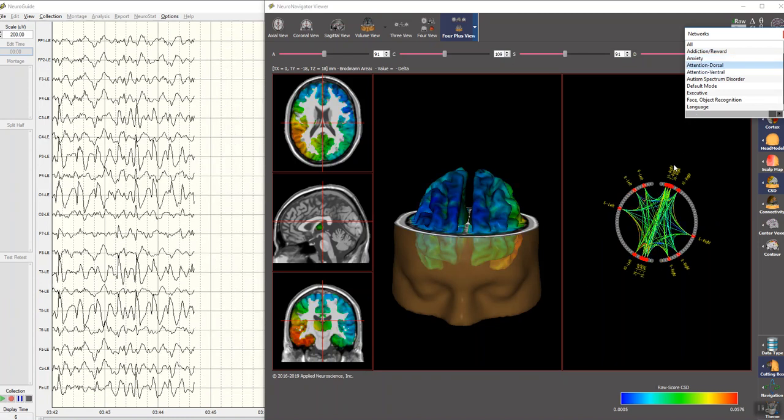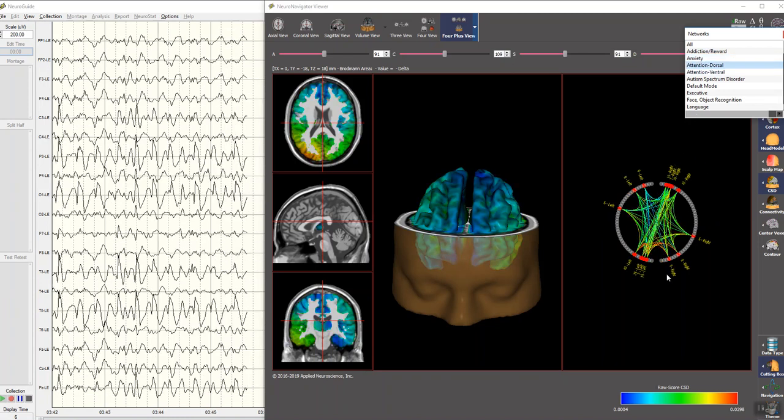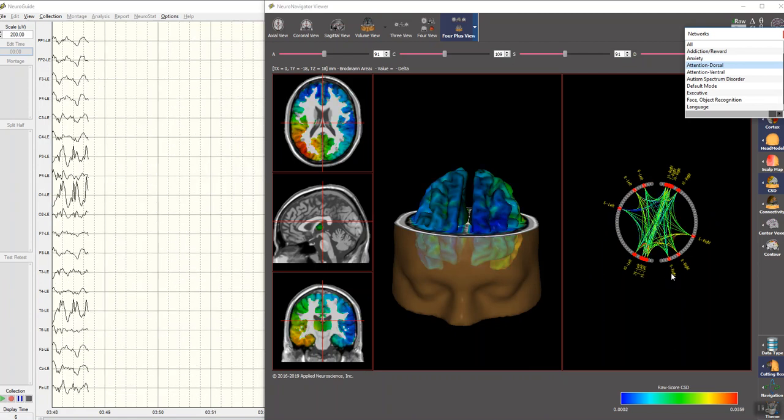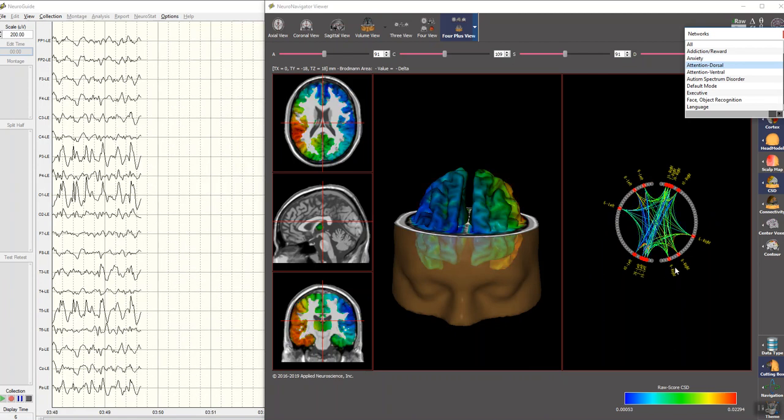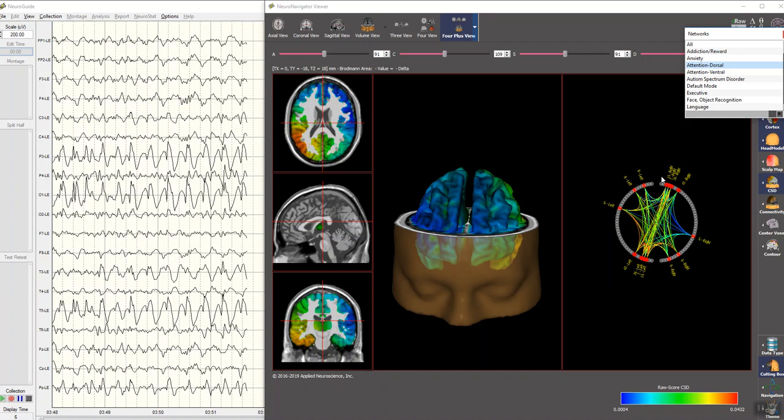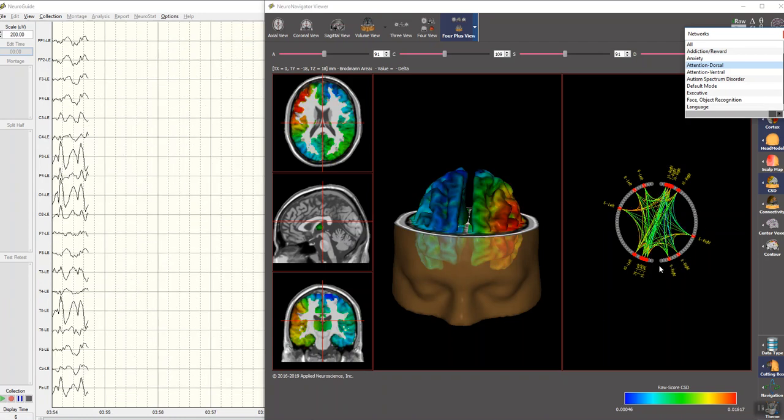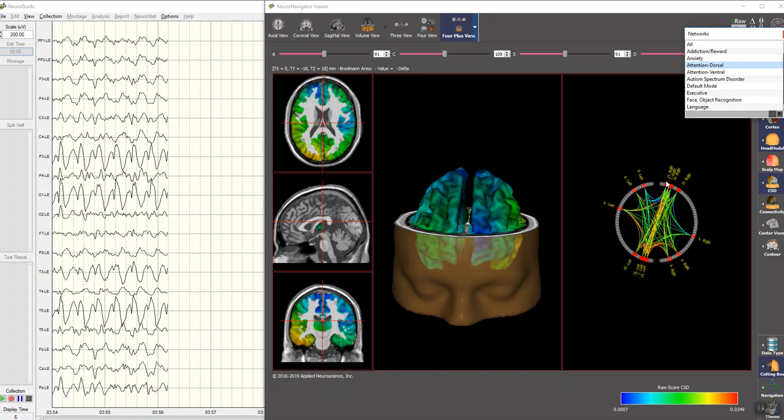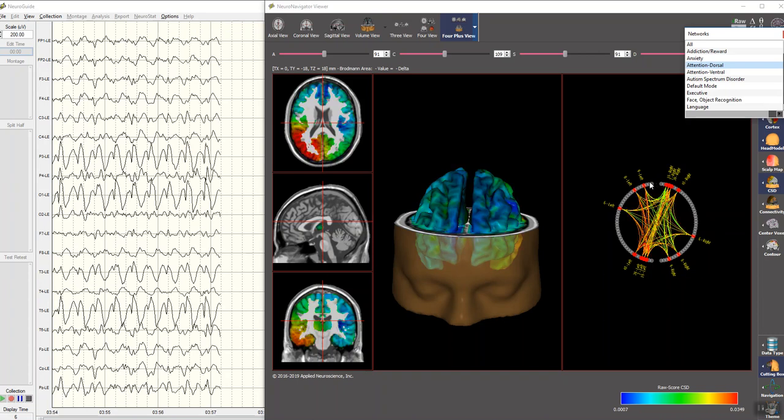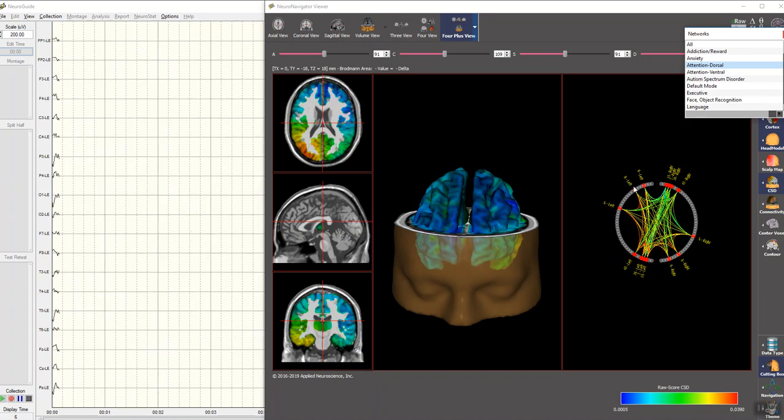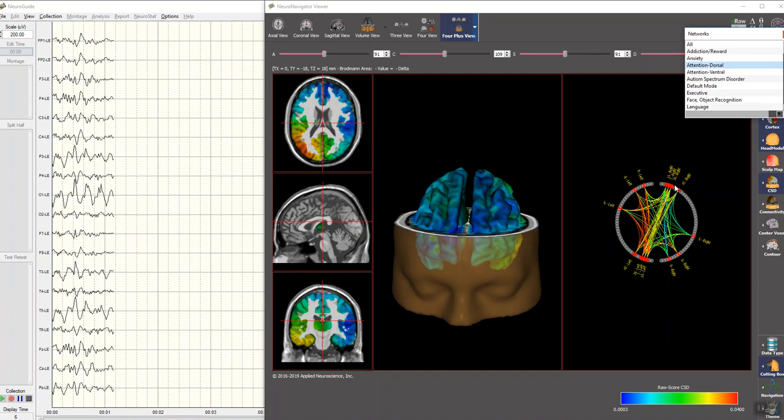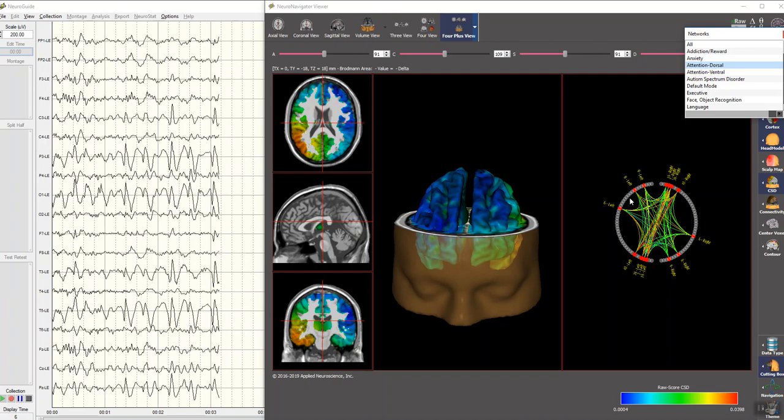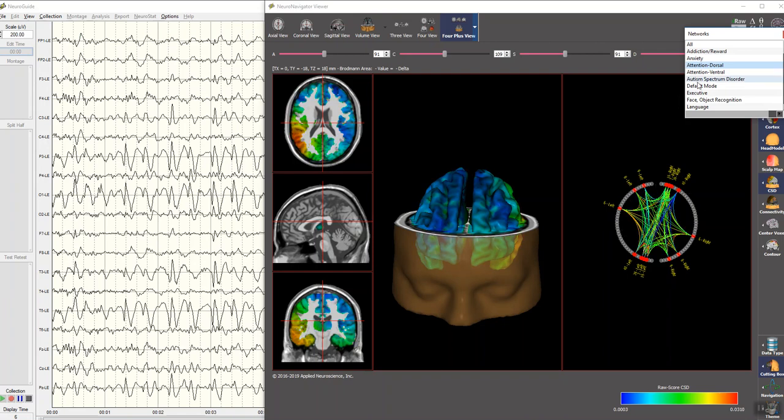This is a two-dimensional plot here on the right of the connectome with the occipital lobes on the bottom, frontal lobes on the top, right hemisphere on the right, and the hemicircle on the left is the left hemisphere, and these are Brodmann areas that are part of this particular network.